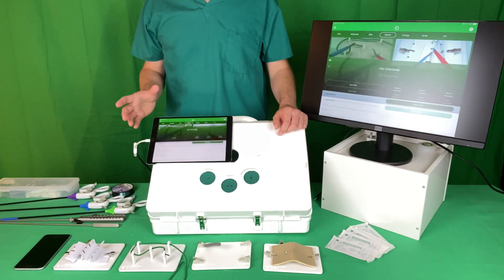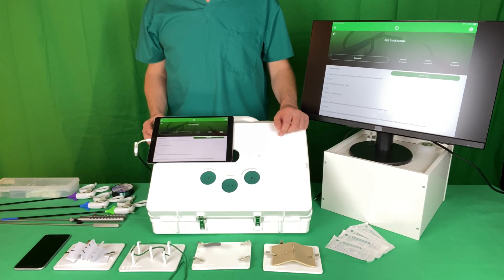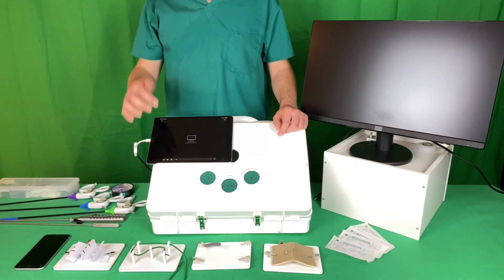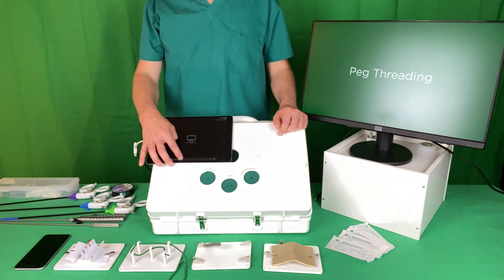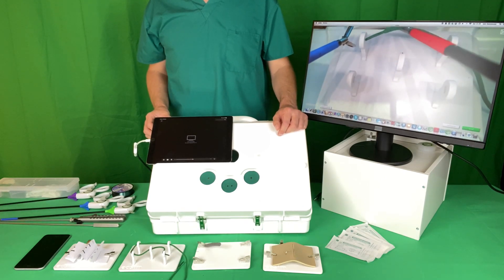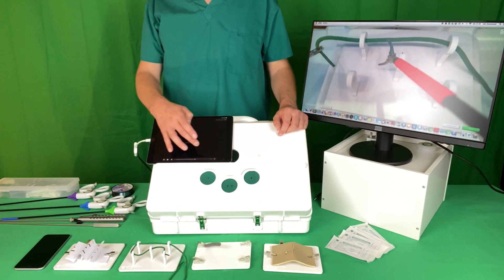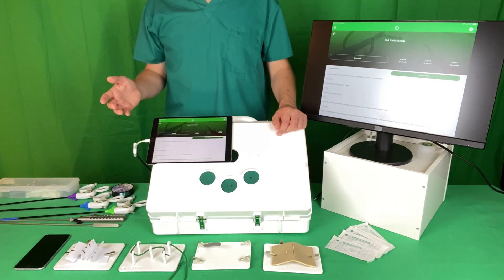Starting with the first task, you get a description of how to undertake the procedure and then a video that demonstrates the technique. You can watch and re-watch this as many times as required until you understand what the task involves, and then you click start task.